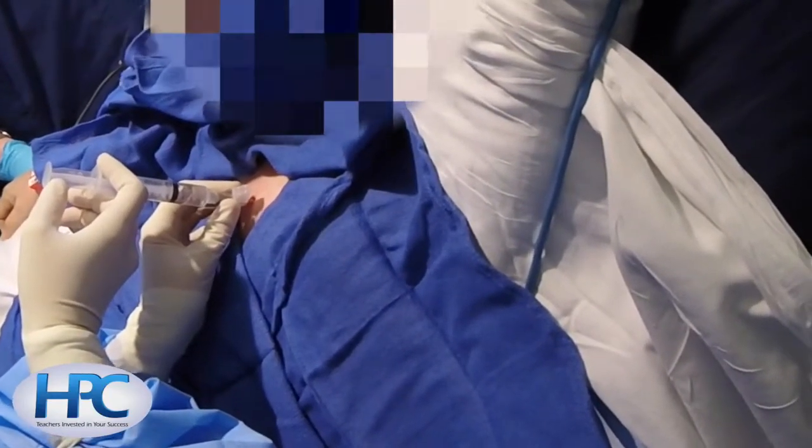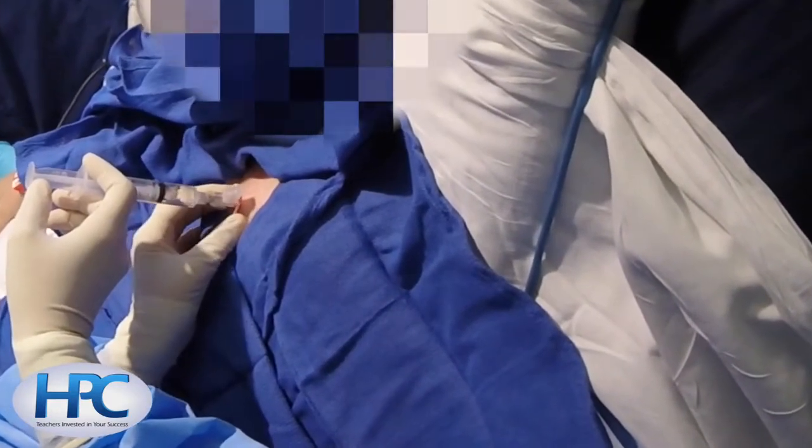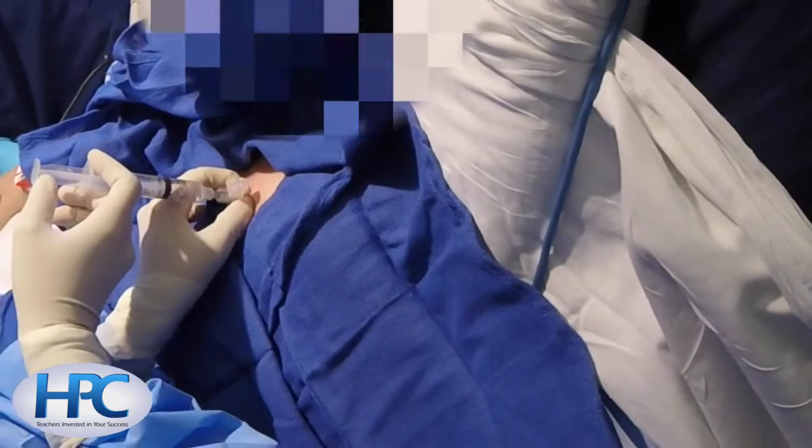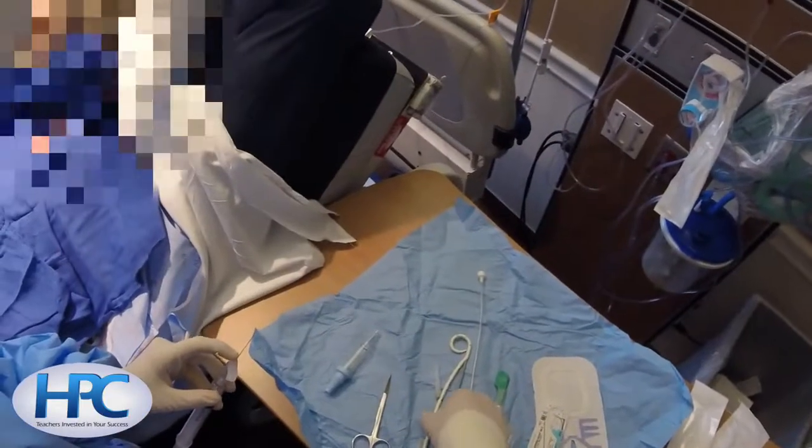The needle is now being advanced back so we know the depth of insertion into the pleura. And there we have the steady stream of bubbles. We're going to grasp the needle, and that is our depth of insertion into the pleural space.